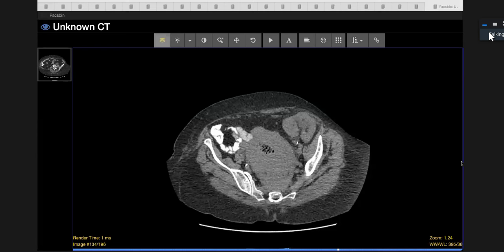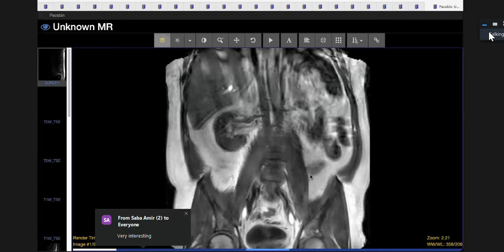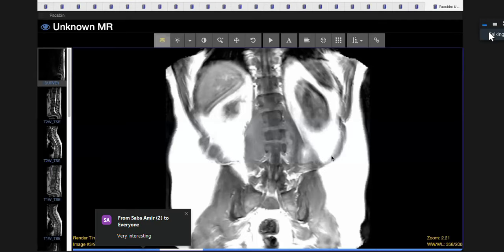Excellent. Right. I think we've got time for more. Let's show you some exciting stuff. Show that one, I suppose. Yep. I'm glad other people find my cases interesting, not just me.